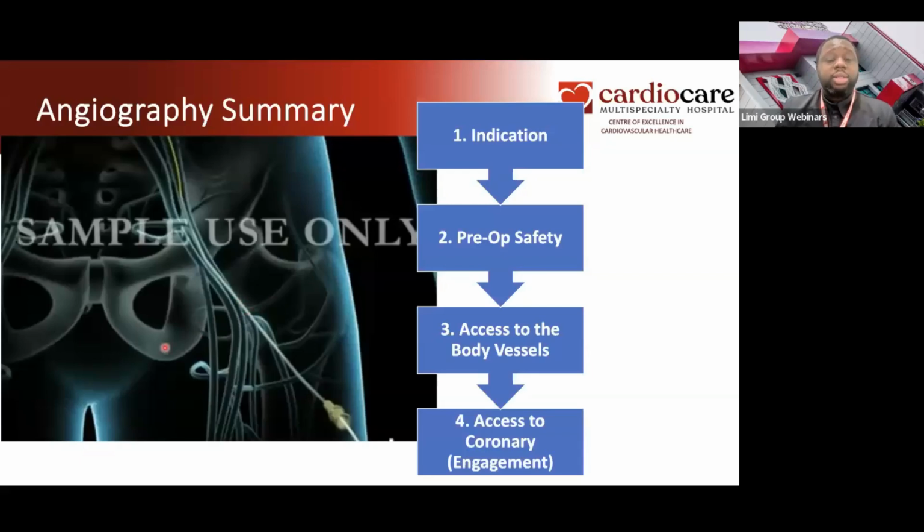after we have done that, we now access the coronaries. So the access to the coronaries is what we call engagement. Okay, I will go through all of this one by one.